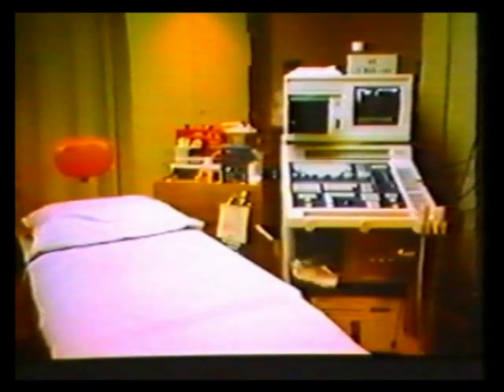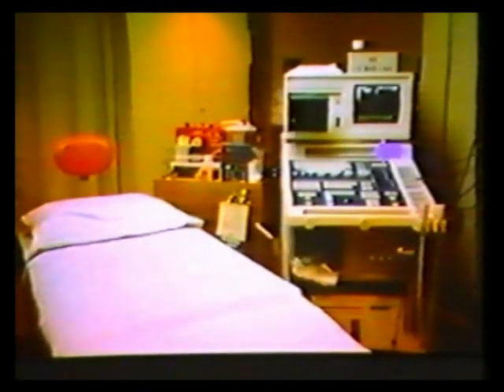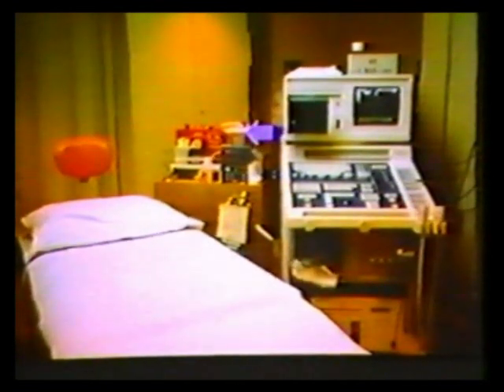This is a typical transesophageal echocardiographic exam room. The table should be height adjustable for ease of the examiner. The echocardiographic instrument is at the head of the table to the patient's left. At the head of the table is an automated blood pressure recording device, suction, and pulse oximeter for monitoring the patient's saturation. The assistant sits at the head of the table, monitoring the patient and assisting during the exam.